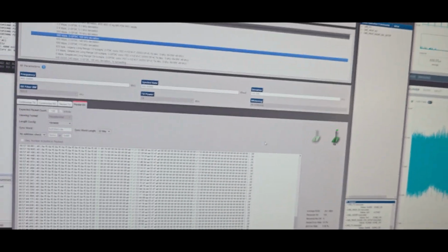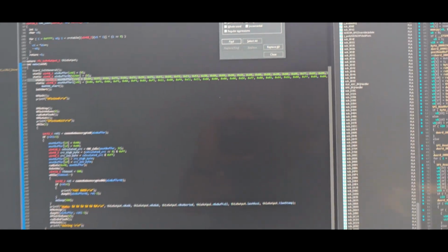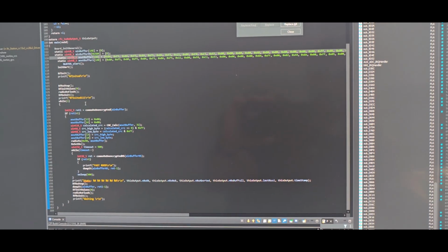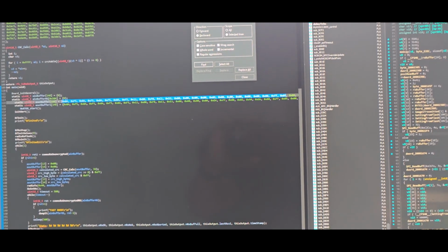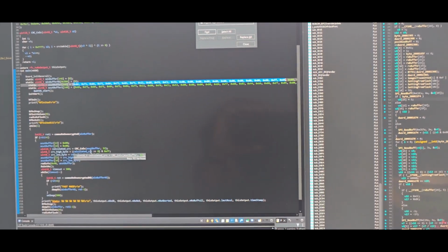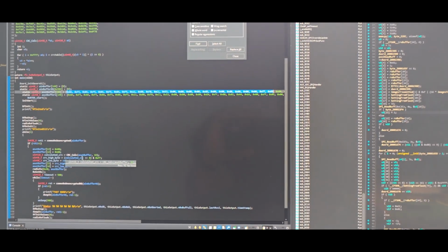And yeah, the natural next step was of course to talk back to the camera, and by reverse engineering the firmware further, I was able to write a custom one. This is basically listening for this information and then sending back the correct data to, in this case, activate the real camera module. It was quite a mess to get it working because the camera data itself is sent at 4 megabytes per second, and the other status info is just at 300 kilobytes per second.